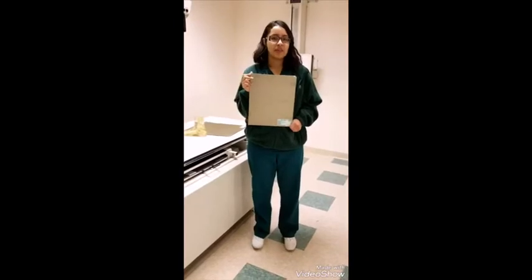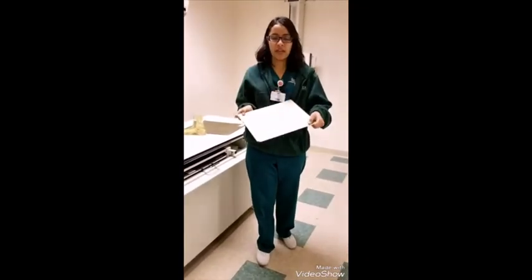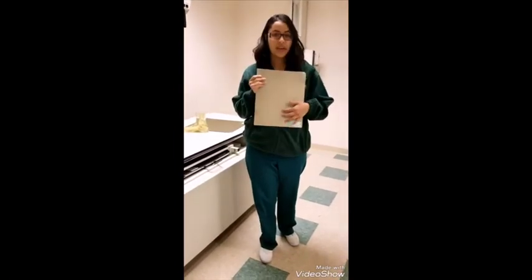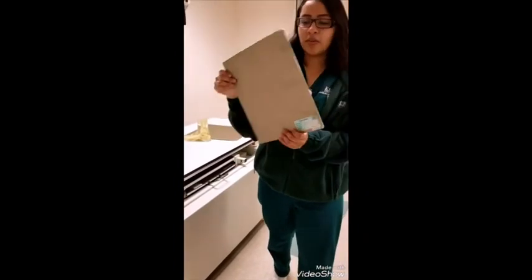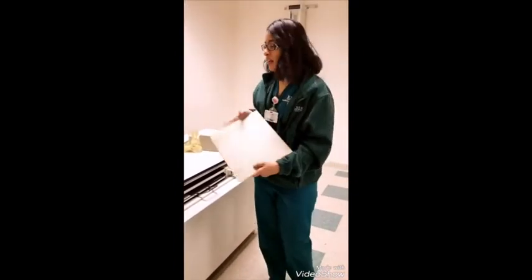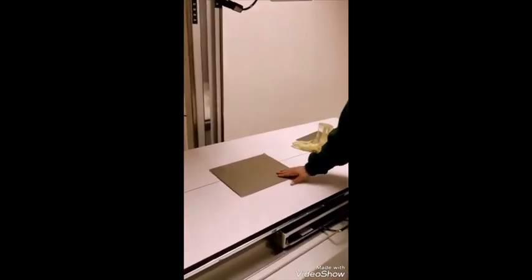Here is the upside down effect. That is when you place the grid upside down. Usually, this part is supposed to go face up. It has the line in the middle, and if you don't see it, it's going to look like this. If you place it like this, you'll see a strip in the middle.